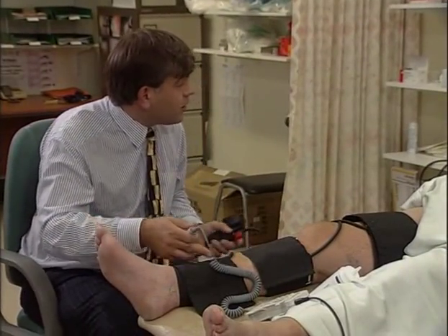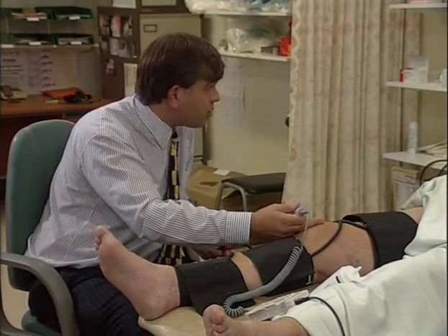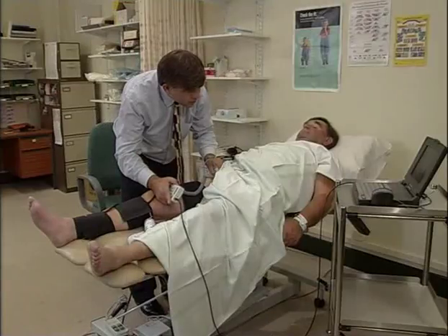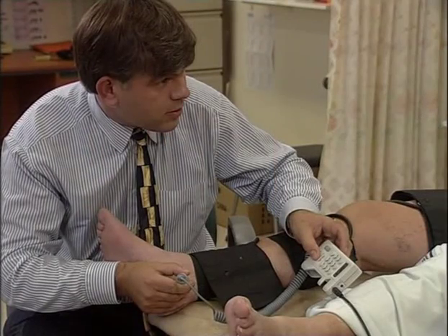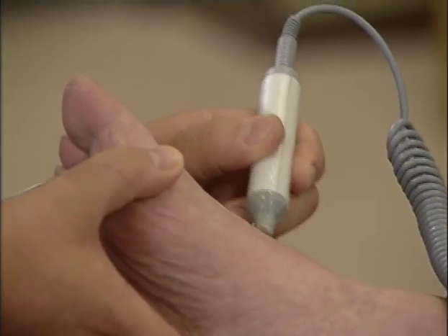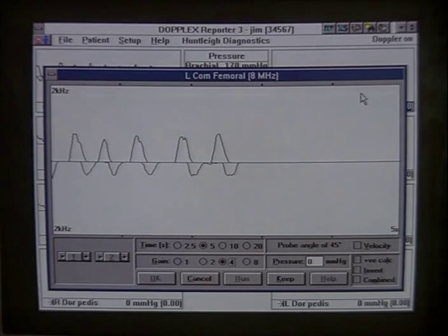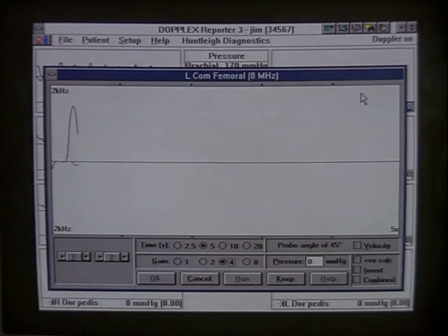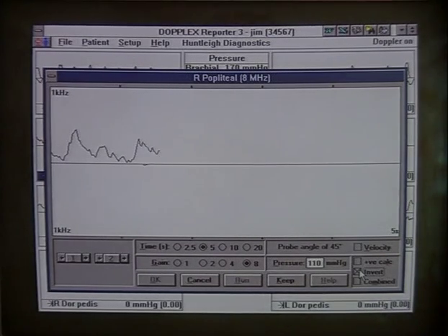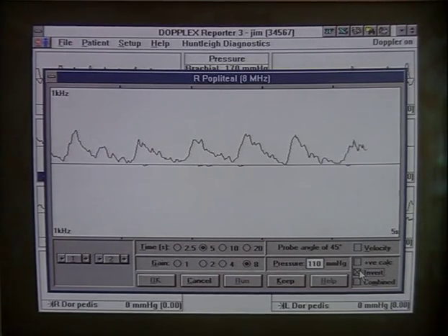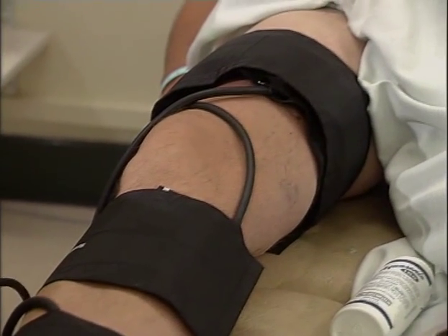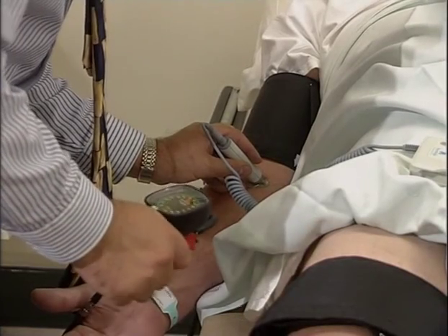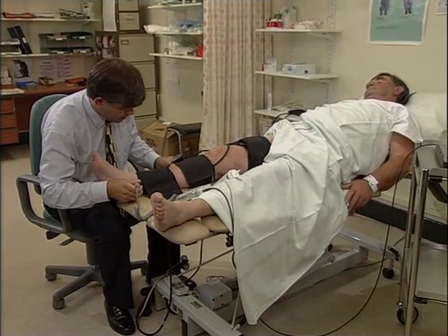Waveforms are often used in conjunction with segmental pressures to assess severity and location of arterial disease. Making sure the patient is relaxed, the arterial readings are taken at four sites. In this case, the dorsalis pedis signal is too weak to record. The femoral waveform is relatively normal, although the patient's cardiac arrhythmia makes recording the waveform more difficult. The popliteal waveform is damped and the reverse flow in the third phase has disappeared. Using segmental pressures, a clearer idea of where the stenosis can be found is built up. Pressures are taken on the arm, the thigh, below the knee, and then at the ankle.